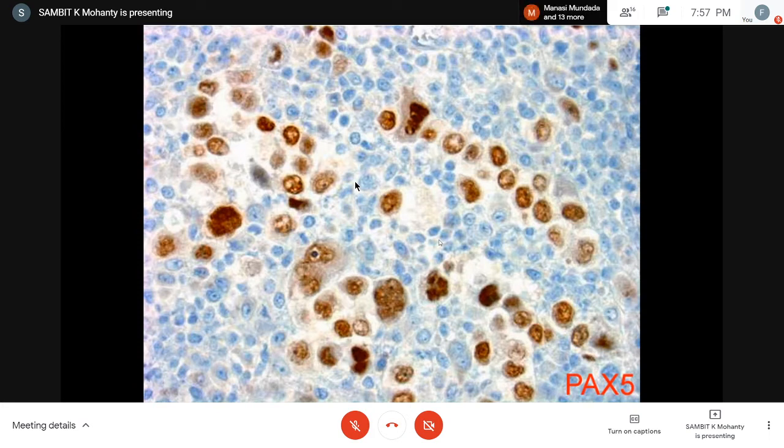And here another thing is we have a CD20 positivity. The thing is these cells are CD45 negative, though CD45 negative B cell lymphoma is well documented. I also did a CD79A and a CD19 in this, and both were negative. Okay. Because I did have that question. Is it Vishal? Pulkit only. Pulkit, yeah. Exactly the same question. I never thought of a Hodgkin in the first go. I was almost on the verge of signing this case as a gray zone lymphoma.